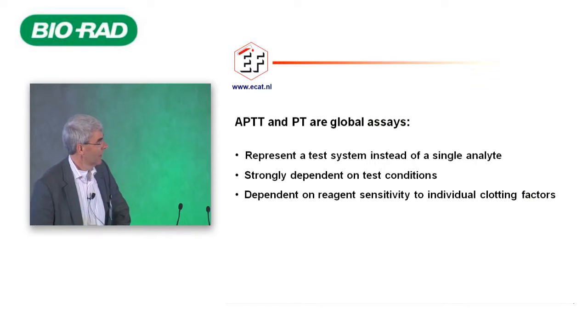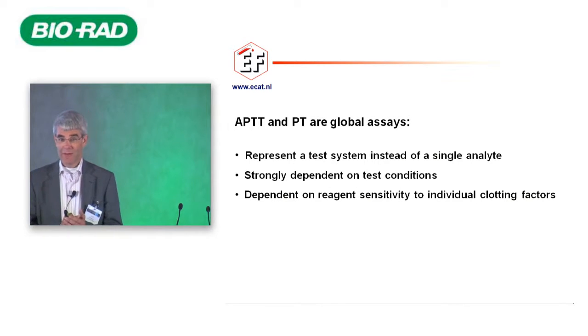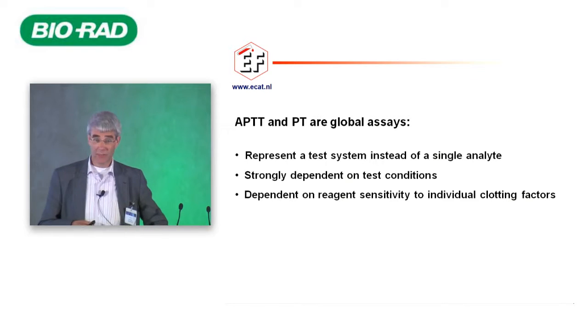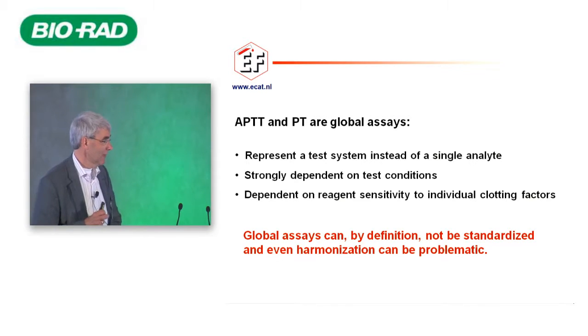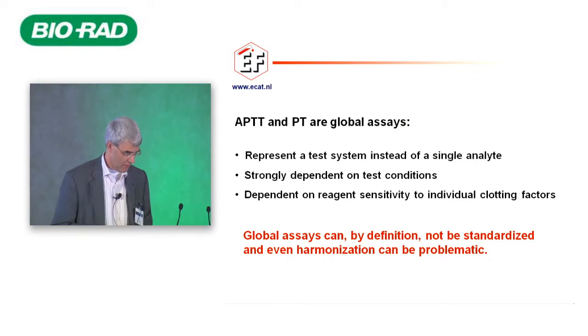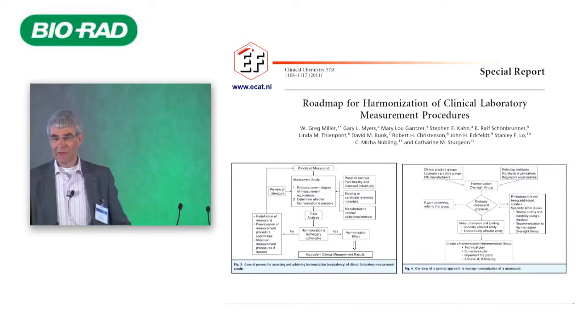although we think it is standardized. We have to realize that APTT and PT are global assays. It does not represent a single analyte, but it represents a kind of test system. You try to mimic the clotting process in your assay system. And that depends strongly on the test conditions chosen. It depends also very much on the reagent sensitivity to these individual clotting factors. So in my opinion, by definition, global assays can never be standardized. And it will be even hard to harmonize them. Although there are several possibilities and progress made in that, but as I showed also for the PT, it is not, let's say, the end of the story.